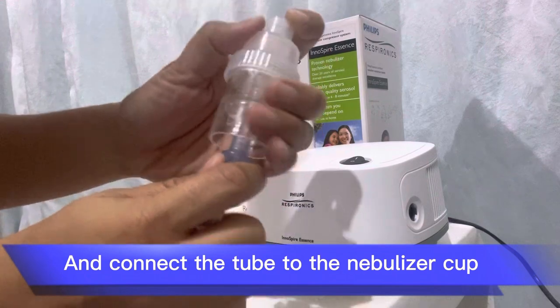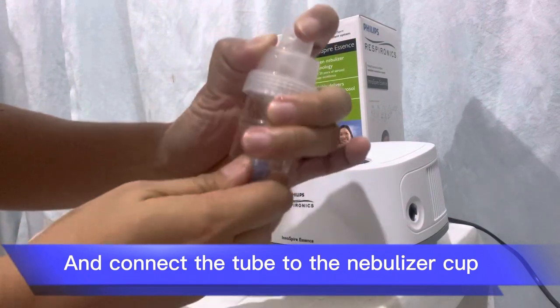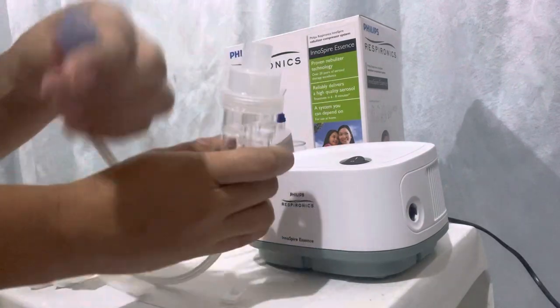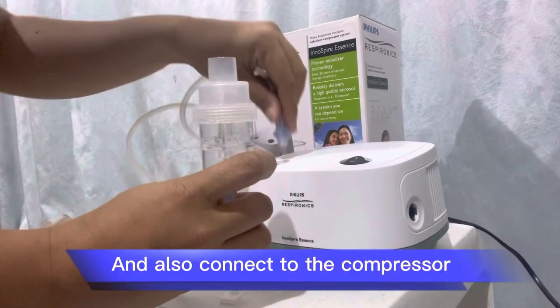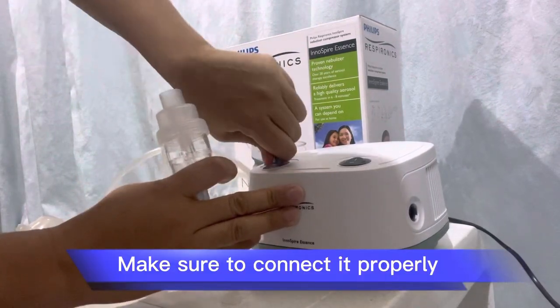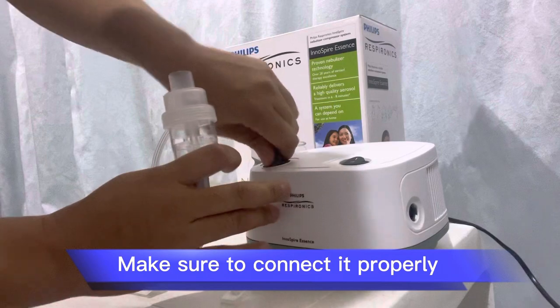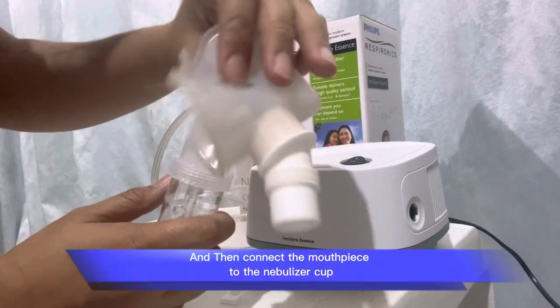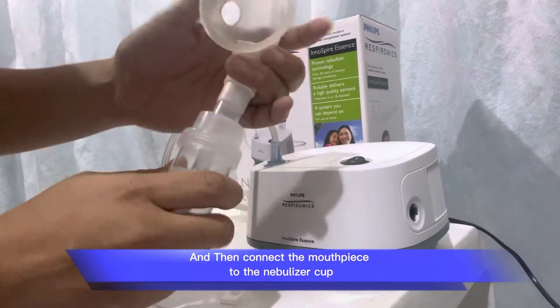Connect the tube to the nebulizer cup, and also connect it to the compressor. Make sure to connect it properly. Then connect the mouthpiece to the nebulizer cup.